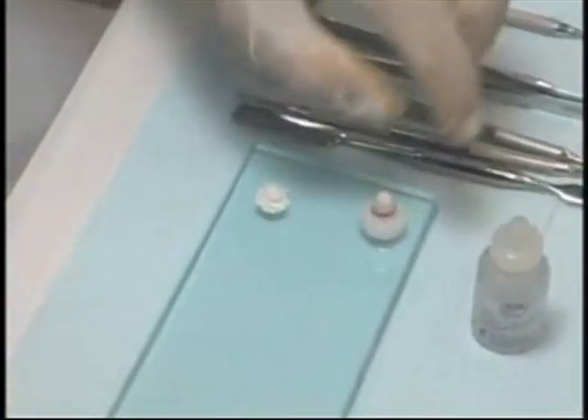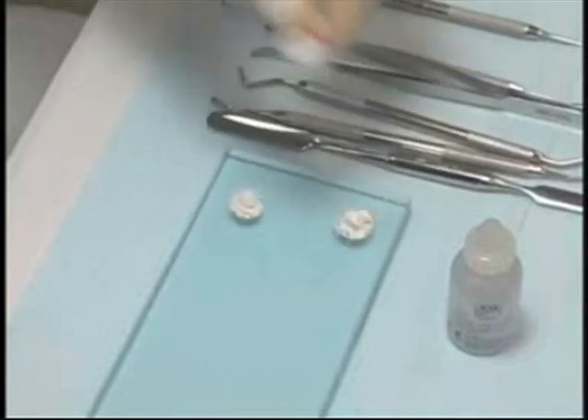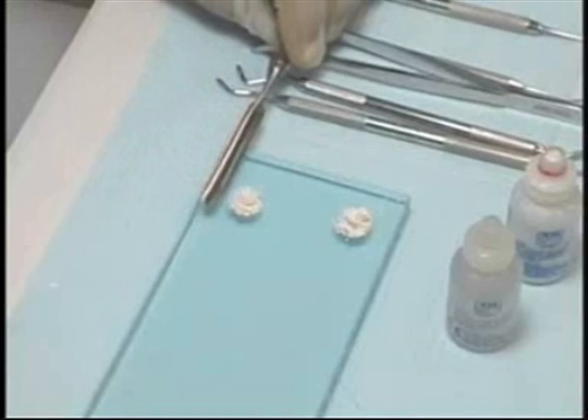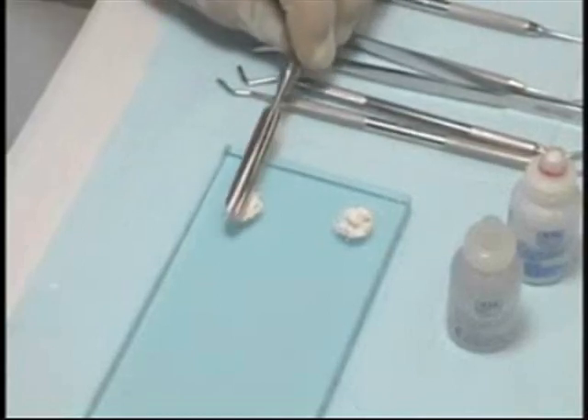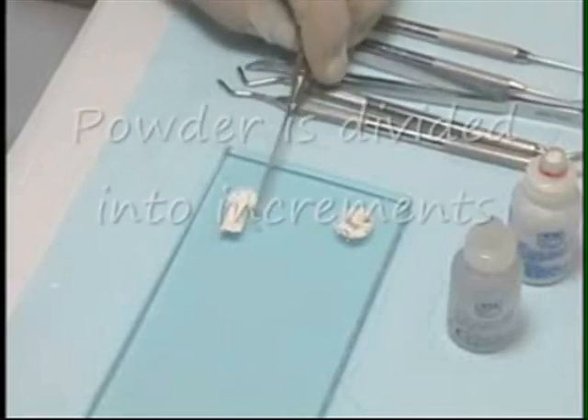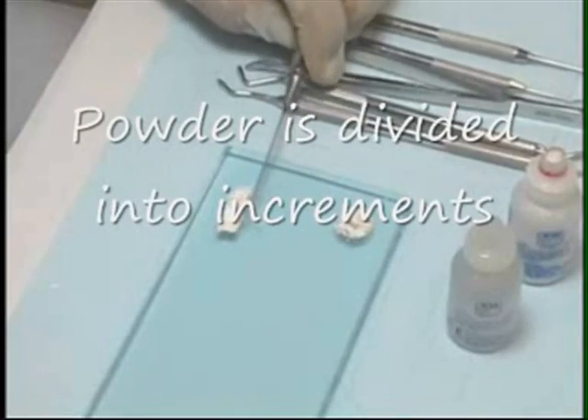Place another full cap on the upper right corner of the glass slab. The powder — the initial two thirds bottle cap — is divided into six equal parts using the flexible blade, the thin and tall side of the spatula.